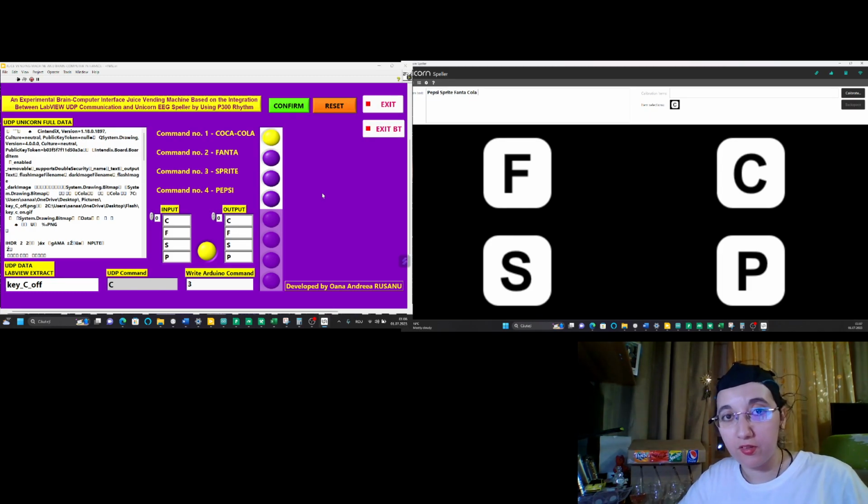So this project is aimed at training students into getting familiar with the brain computer interface research domain, and also it could be a starting point for people with neuromotor disabilities to get familiar with this innovative technology, to perform the first steps.